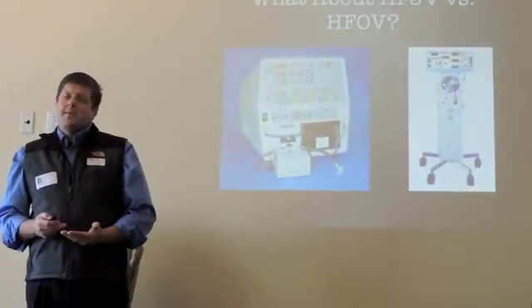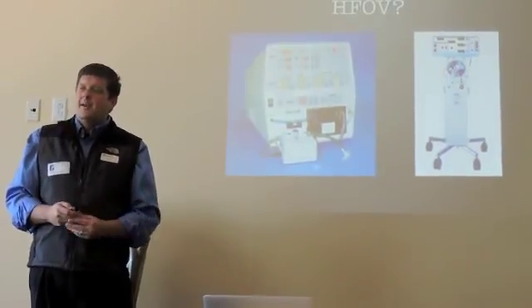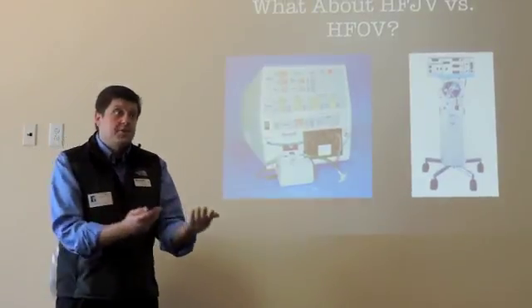So are both high frequency ventilators, are they the same? Kind of, and no. Yeah, they're both high frequency, which means there are a lot of similarities, meaning it's very gentle on the lungs.